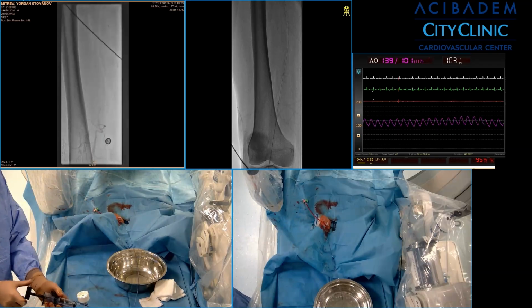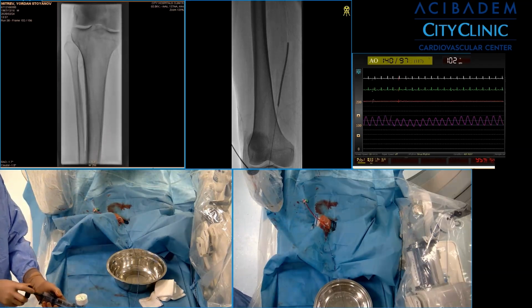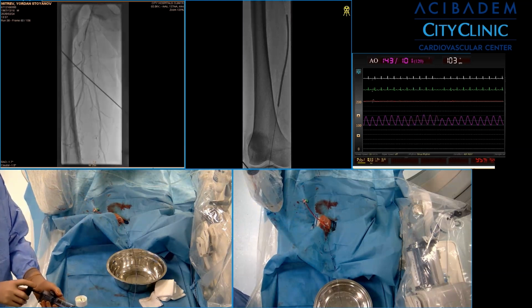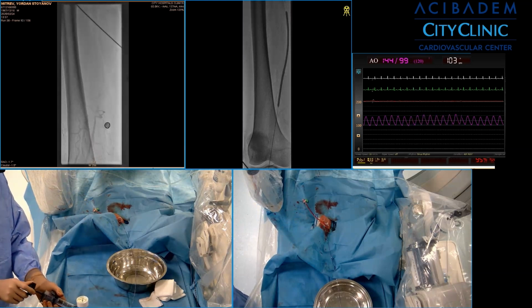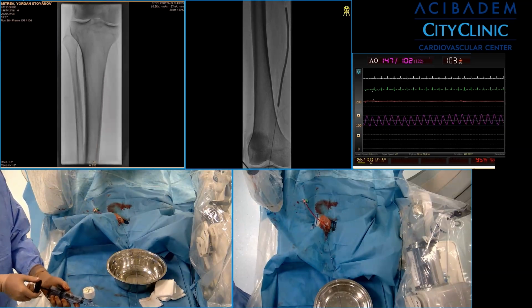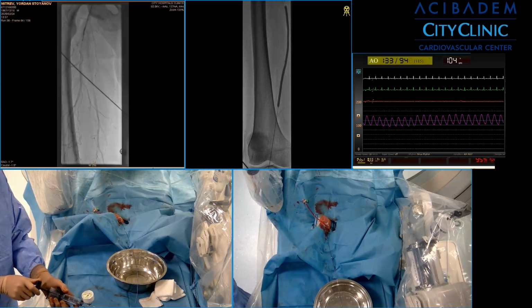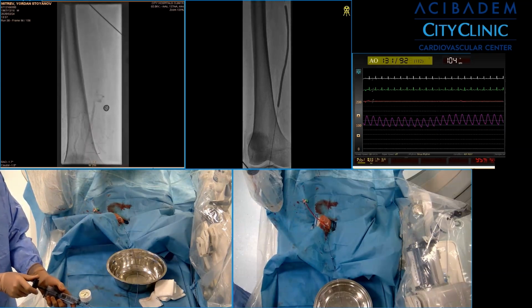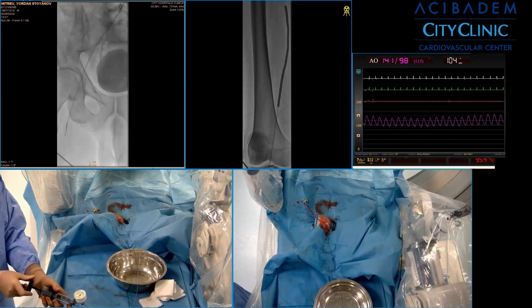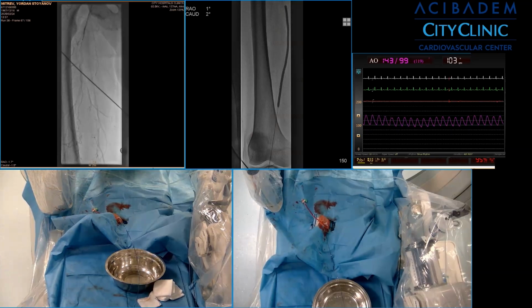But it's very comfortable for me to work from the posterior tibial artery, because the foot of the patient is not in the zone of the introducer. In fact, it's also very comfortable for the patient to maintain the position, because it's a very natural position of the leg during the puncture.